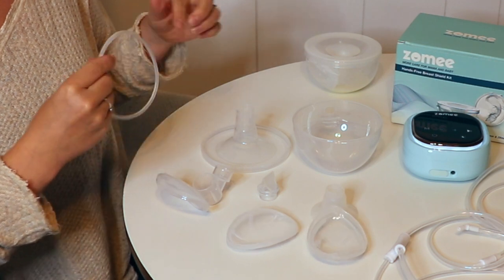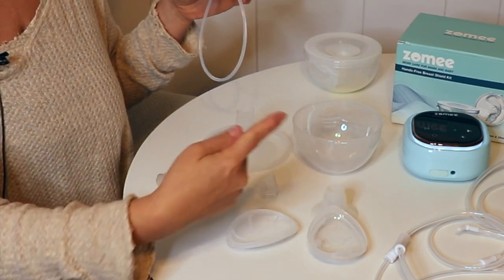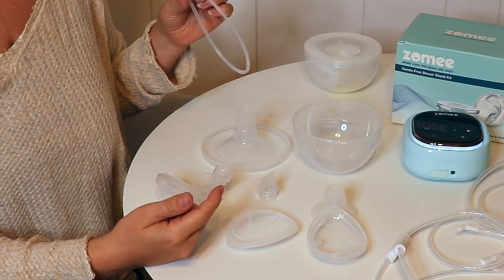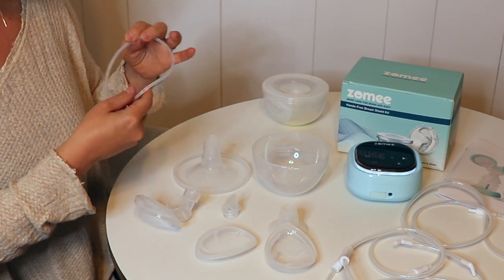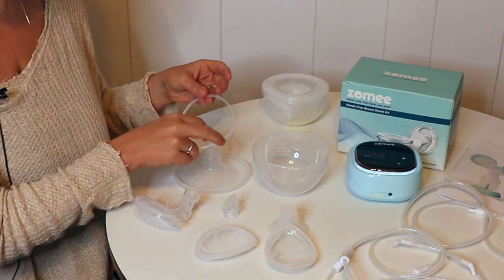This is just from one cup, and we have eight pieces to wash per side — so that's 16 parts overall. That may or may not be an issue for you, but just something to consider if you are going to be pumping a lot. You may be washing a lot of pump parts if you're using these collection cups.